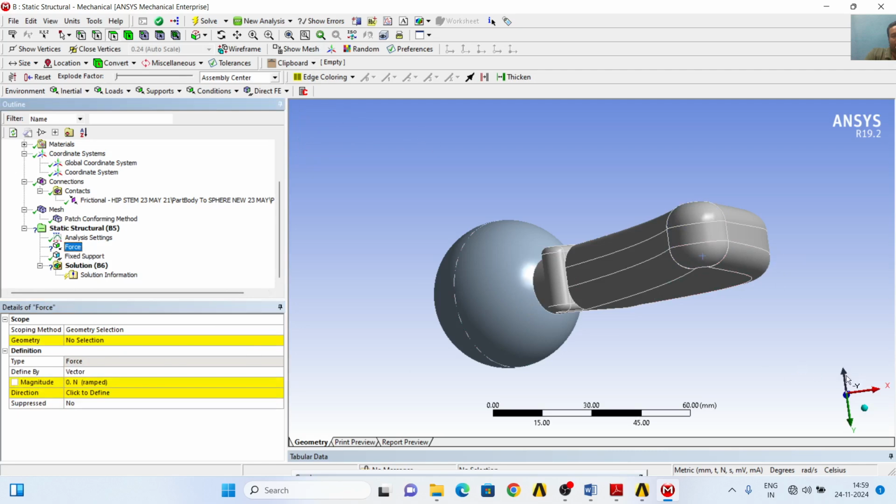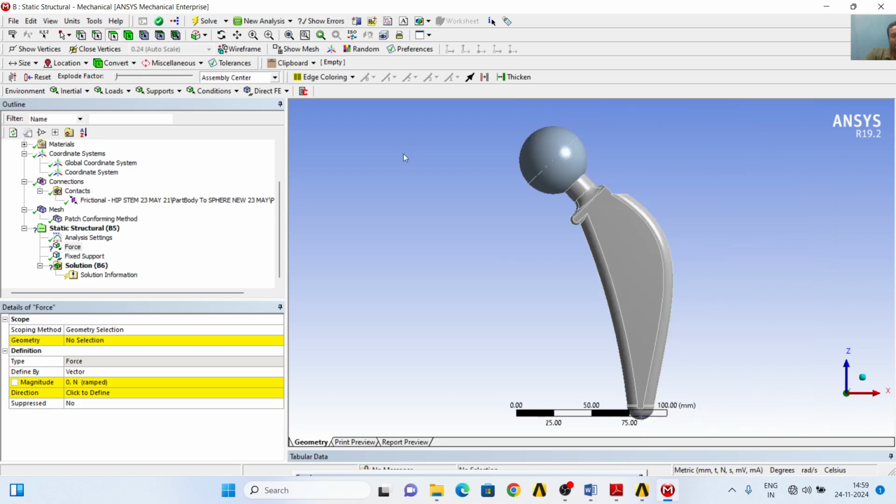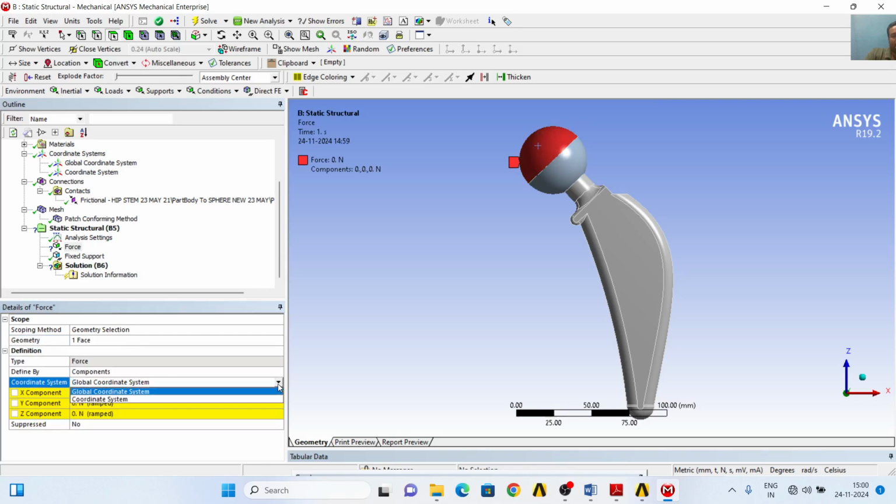I will create a force here, reset the geometry, and apply the force at the upper face of this sphere. I will take the new coordinate system which I have predefined, and I will create a load of minus 1500 newtons. I am taking the force randomly. You can refer to papers for a better or more accurate analysis.